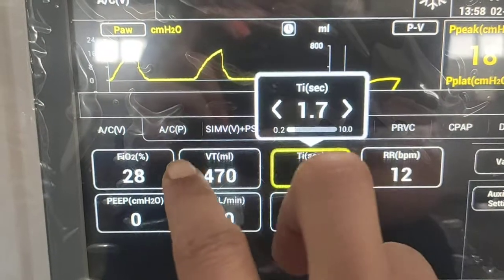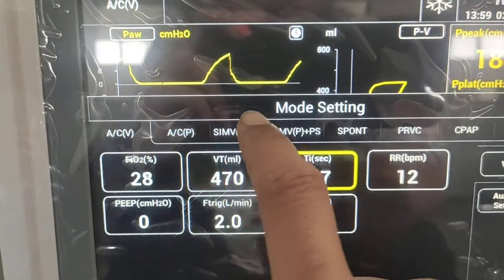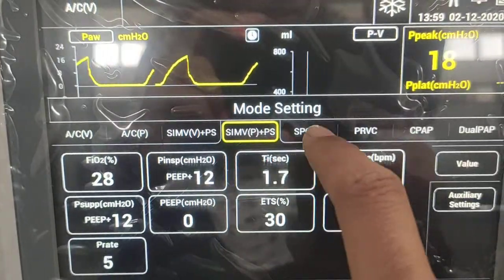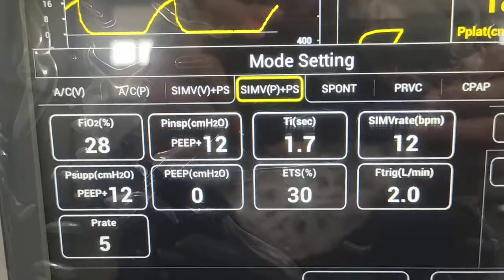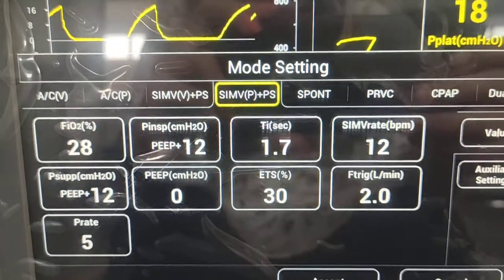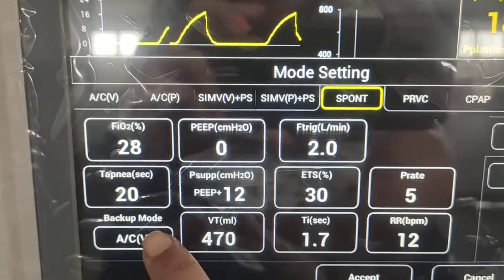In Assist Control P, SIMV P, and Spontaneous modes can be used as both invasive and non-invasive ventilation. In Spontaneous mode, a backup mode is also provided for added patient safety.